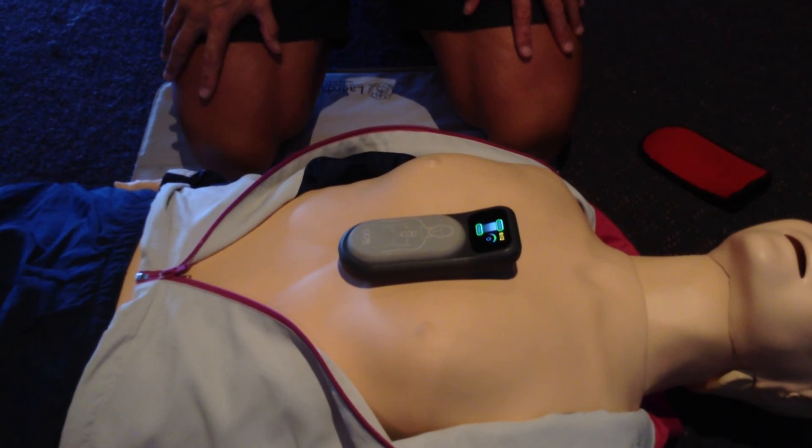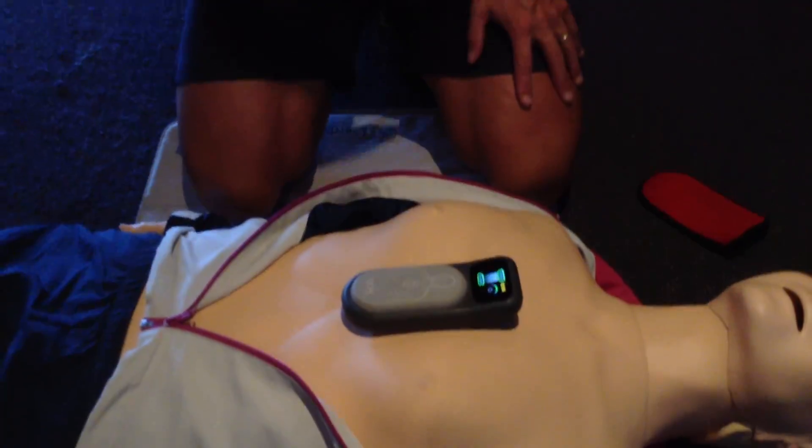This is really, really important in terms of how the feedback software works. It also significantly impacts survival for patients the longer our hands are off the chest. So it's a very, very useful device.